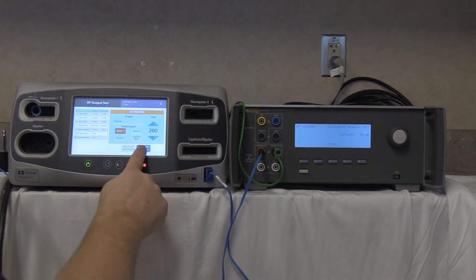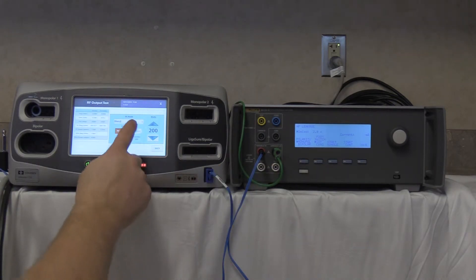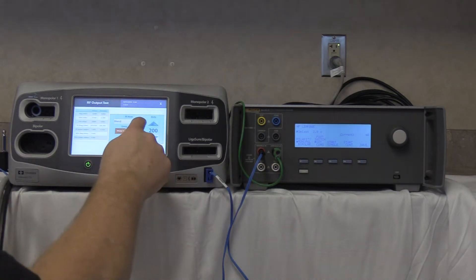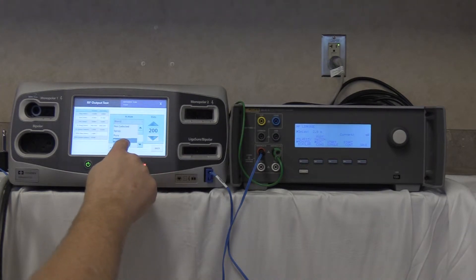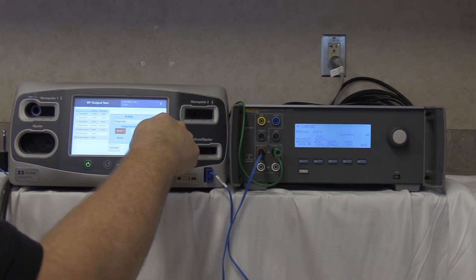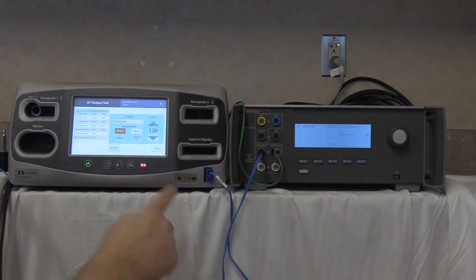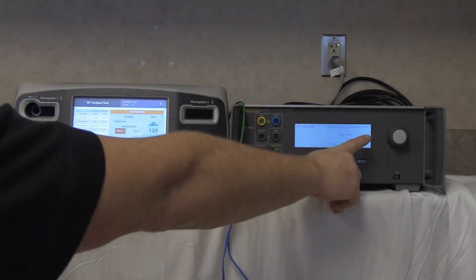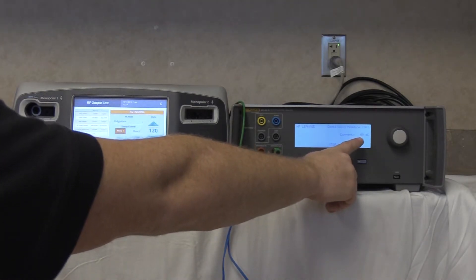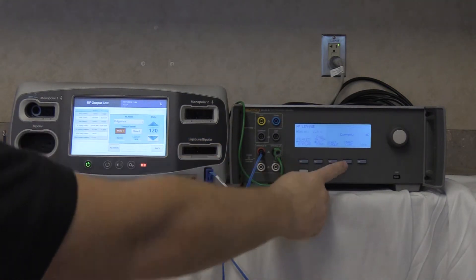Deactivate, no-hold, and stop. Next, full coag at max setting of 120 watts. Start continuous and activate on the FT10. Reading is 59 milliamps. Deactivate, no-hold, stop on the QAES-3.